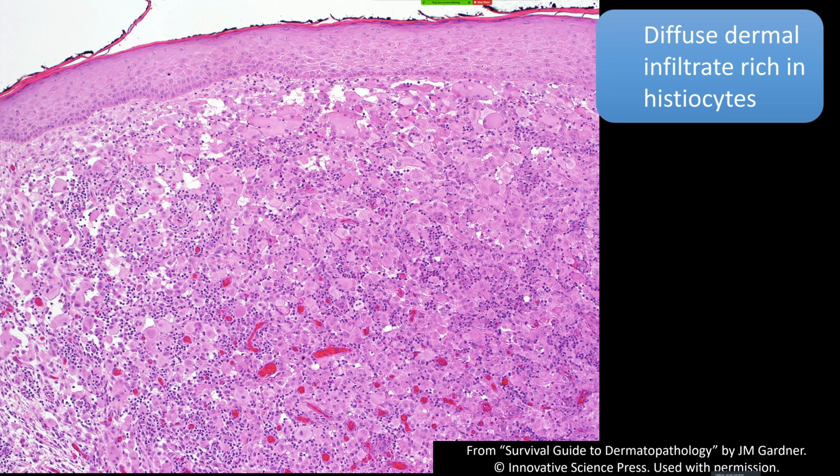Now, this is what they look like. They tend to have some similarity, I think, with xanthogranuloma. The difference is the cells are much larger and really epithelioid. They have a ton of dense pink cytoplasm. And the nuclei can look kind of weird and wild. And I would not blame you for looking at this and thinking, gosh, could that be like a carcinoma or epithelioid sarcoma, something bad? So if you want to do a keratin or a SOX10 to make sure it's not melanocytic or epithelial, I would not fault someone for that.